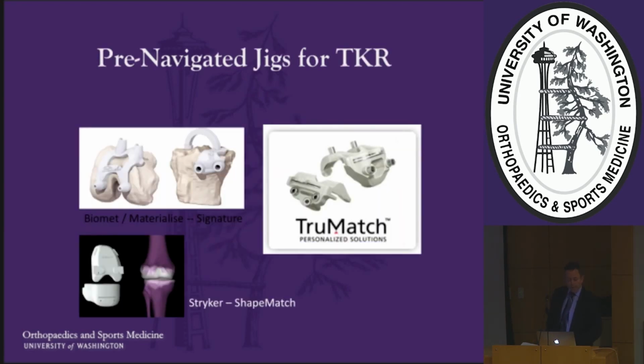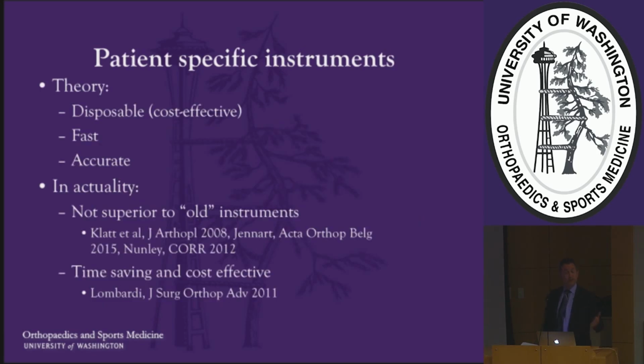What about patient-specific jigs? And this is a variety. Stuart showed a few of these before. The theory is that they're disposable, so they're cost-effective, they're fast, and they're accurate, but unfortunately, as with everything else, nothing spoils good results like follow-up.